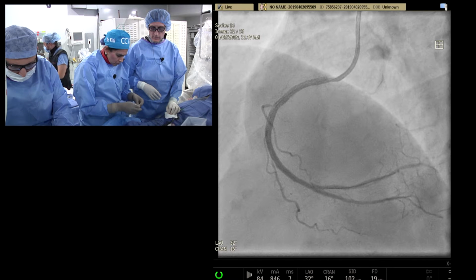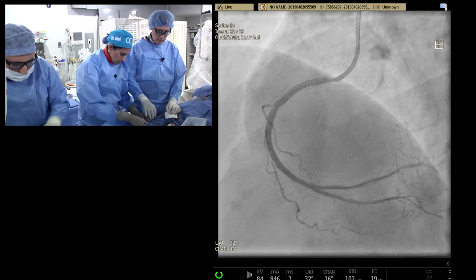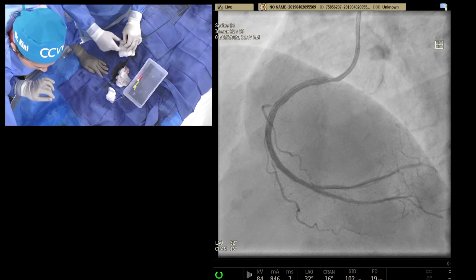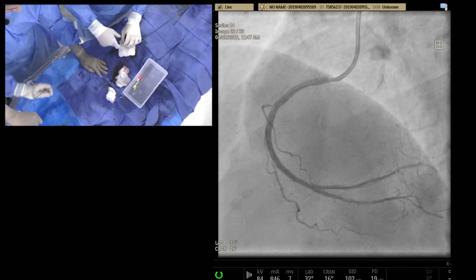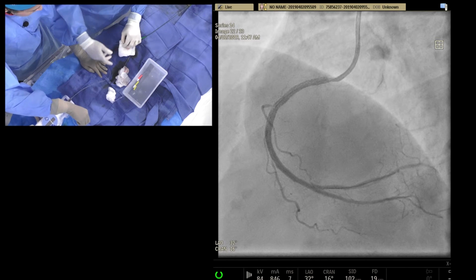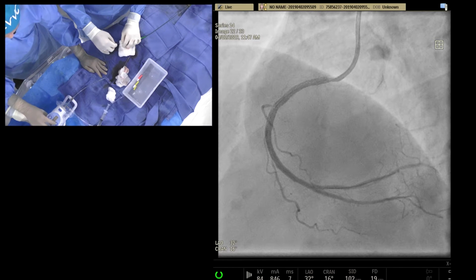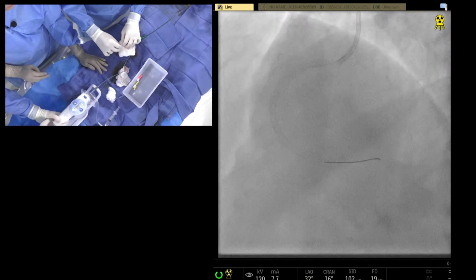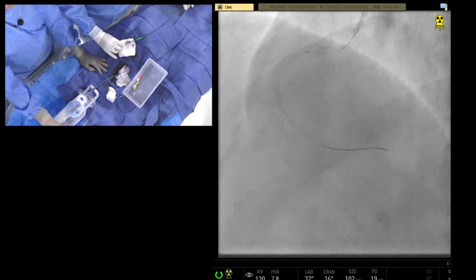So how would you do that, the reassessment? Are you going to put this patient on a Holter monitor? We begin with short-term monitoring. If you put a Holter monitor on, or a 1 week or even up to a 3-week event monitor. If you're not sure, we have implantable loop recorders. Today we have smartphone-based devices, or Apple Watches and other ways that we can survey patients for atrial fibrillation. But I'd like to see a recurrence of atrial fibrillation before committing this patient to a combination of an anticoagulant and a platelet inhibitor.